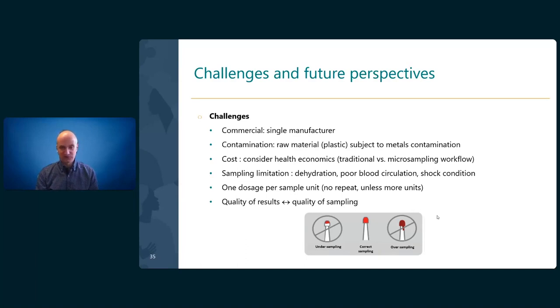You have to follow the instructions provided by the company. It comes with the kits, so all the kits have this sampling procedure included. You have to avoid oversampling or undersampling, because this will have a huge impact on the results, obviously by overestimating or underestimating the results.